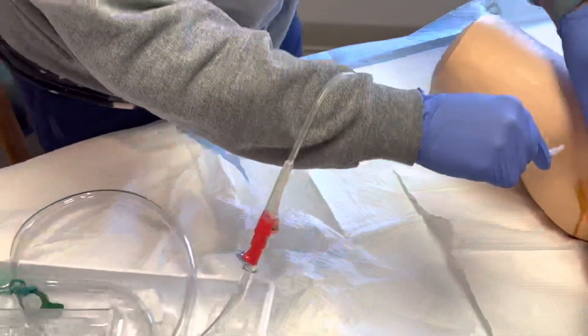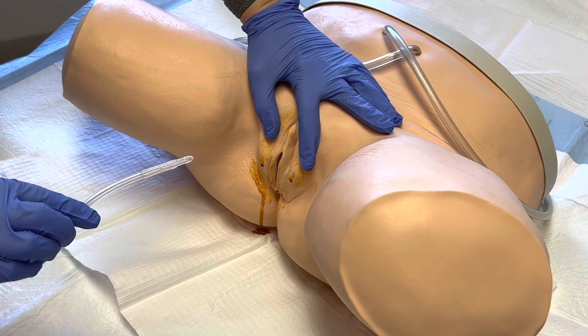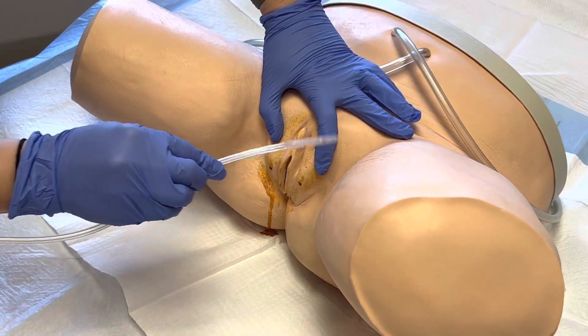Prevent contamination of the sterile catheter prior to insertion. Carefully grasp the catheter within your gloved hand when picking it up. Stabilize it before insertion and take care to prevent bumping up against the patient's anatomy.